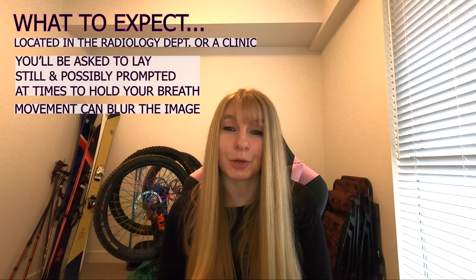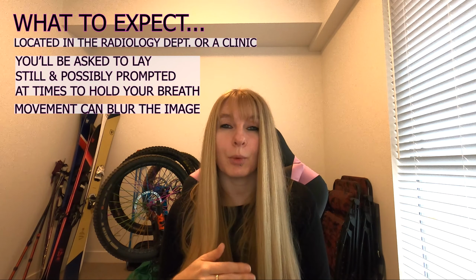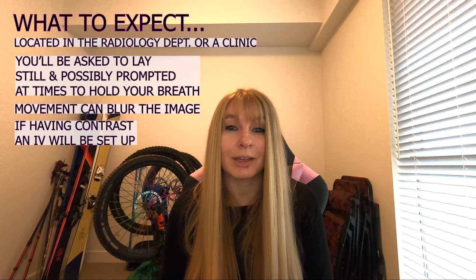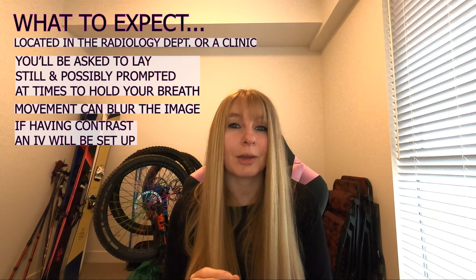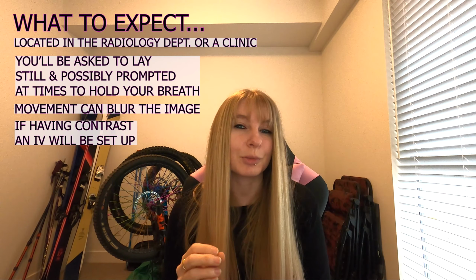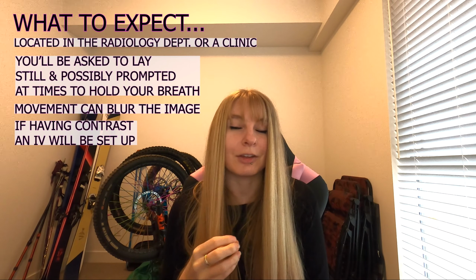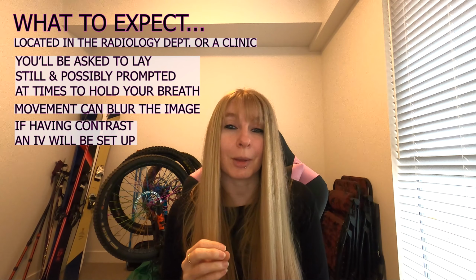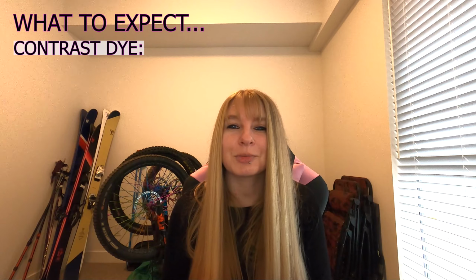As I've always had the contrast dye with my scans, when I first enter the room, that's when they usually set up the IV in my arm so that the dye can be injected. The first time I ever had the dye, the nurse giving me the IV said that the contrast would be quite a strange feeling, that there shouldn't be any pain and it will be quite warm and make me feel like I'm peeing myself. And I can 100% vouch for that.